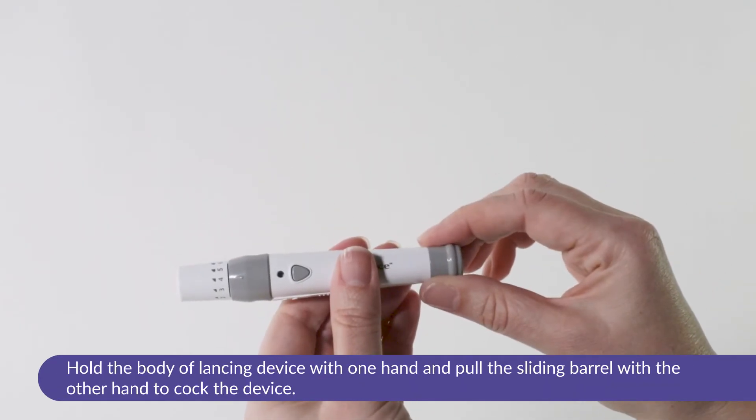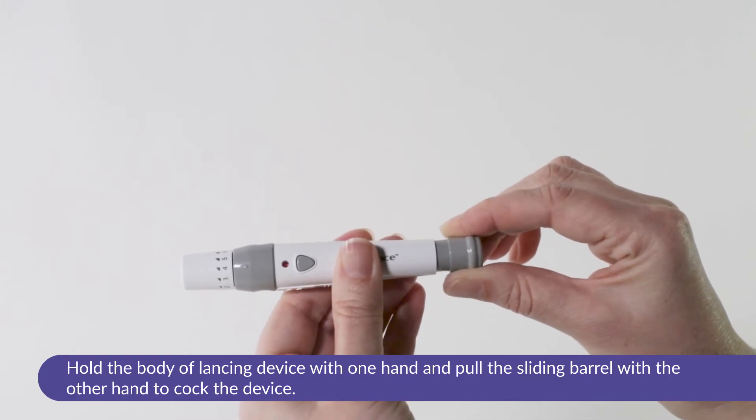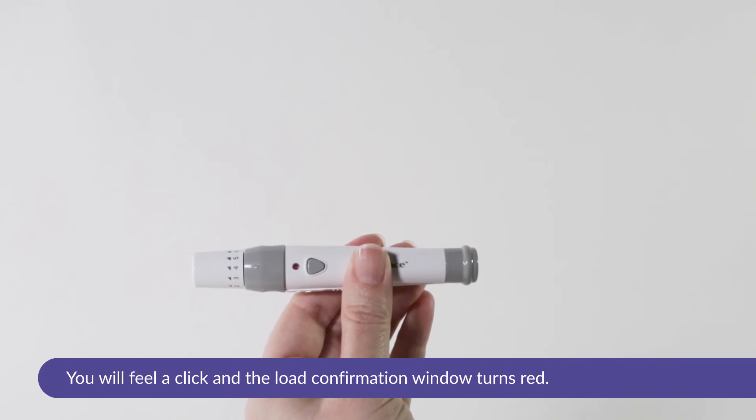To cock the lancing device, hold the body of the lancing device with one hand and pull the sliding barrel with the other hand. The device is loaded when you feel a click and the load confirmation window turns red.